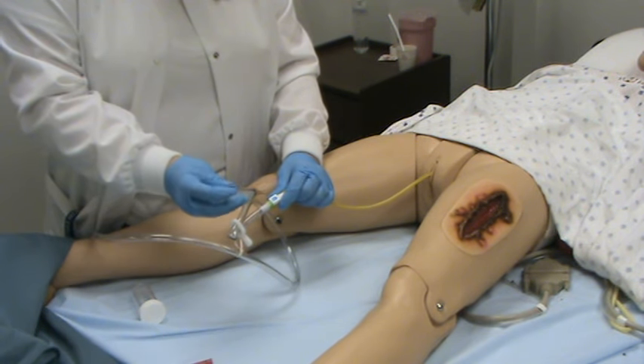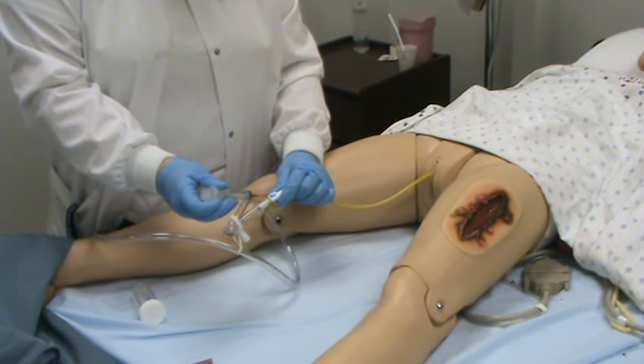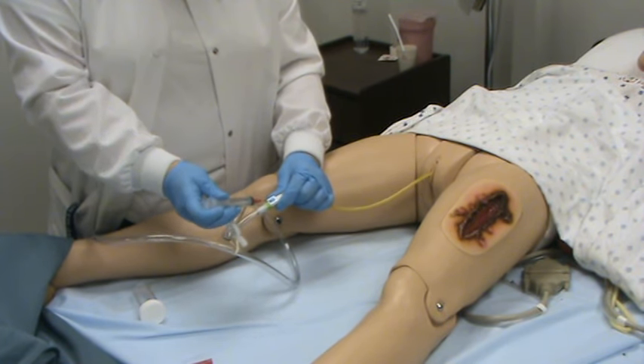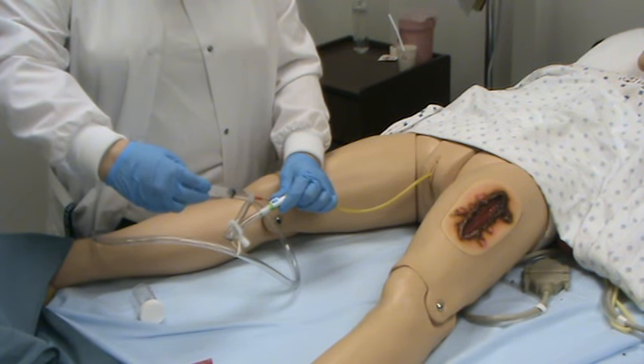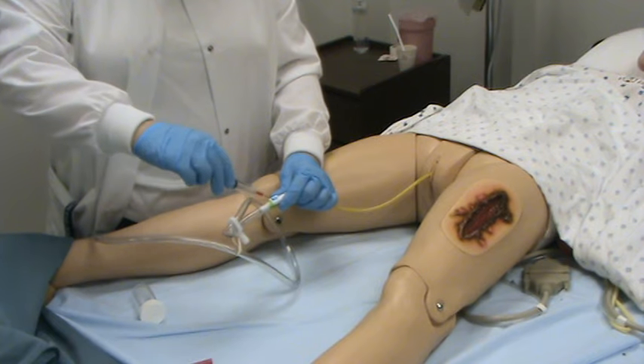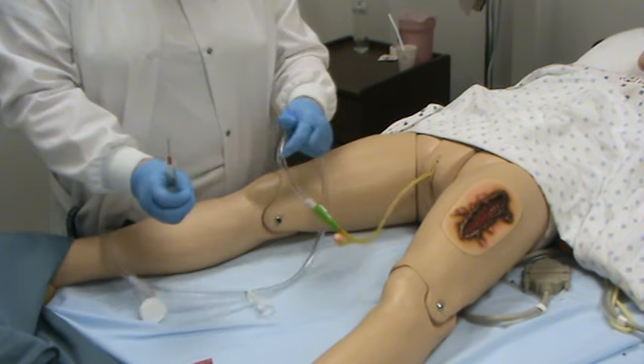You want to insert the needle at an angle — I'm using a larger needle here so you can visualize it, but you need to insert it at an angle. Once you have it at an angle, draw back the desired amount, usually 3 to 5 mils. Then remove your syringe and unclamp the catheter.